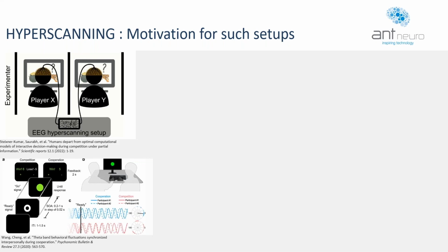Here you have a response time measurement between 2 participants. What you see in the first slide is this gray marker, which tells the participants that the experiment paradigm is ready to begin. You see the green marker, or the green slide with the green dot, which basically is the go signal for the participants. Once again, here there was actually no EEG data collected, but more response time measures that were looked into.